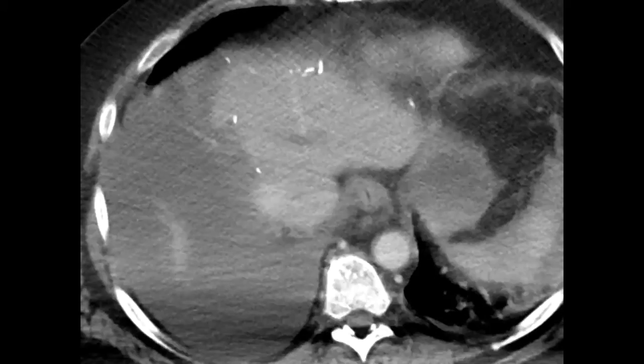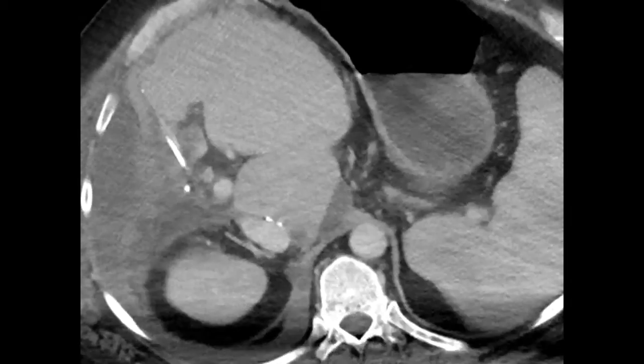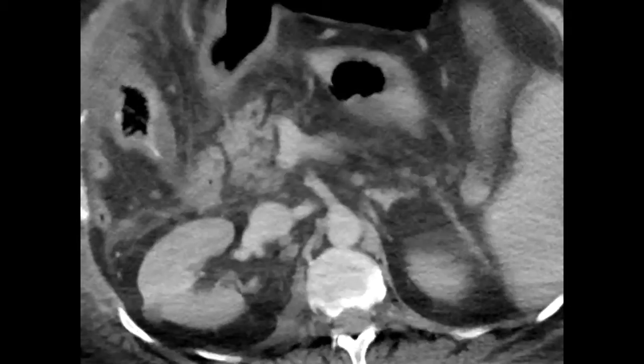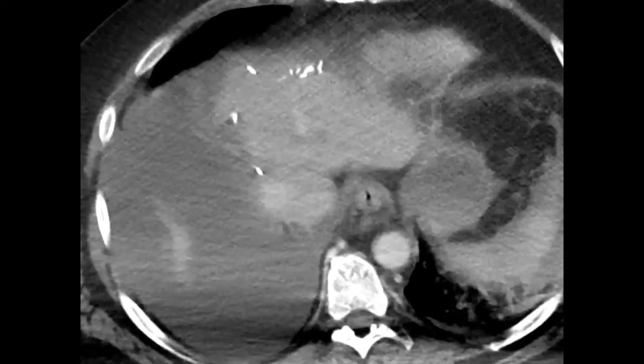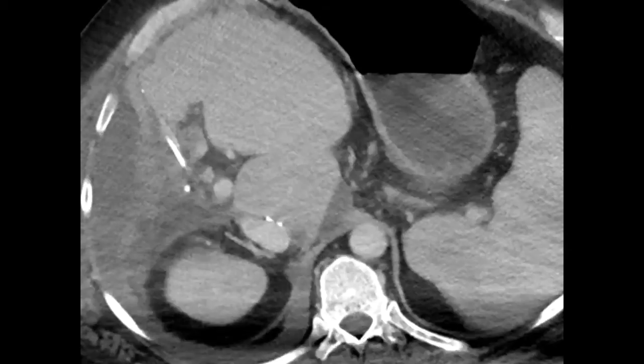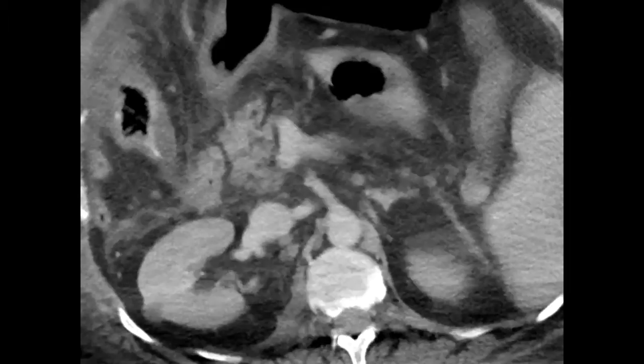Here is an imaging 2 days after resection of segments 5, 6, 7 and 8 and partial resection of segment 4. There is some fluid around the liver and the patient also has a large pleural effusion on the right side, but what you can also see is that segments 1, 2, 3 show a very good hypertrophy after portal vein embolization.